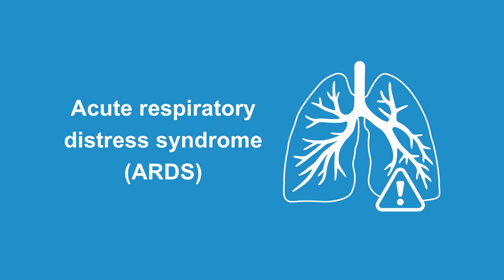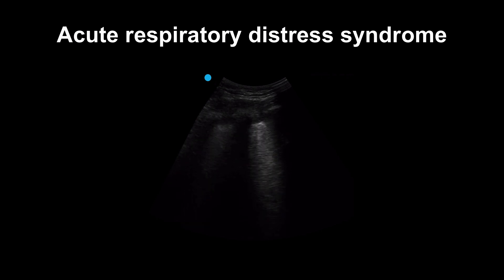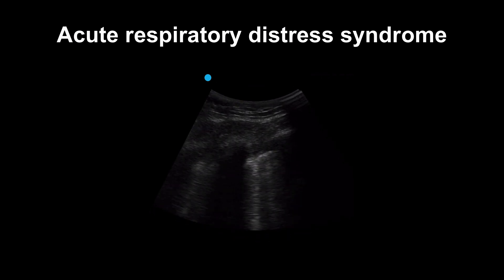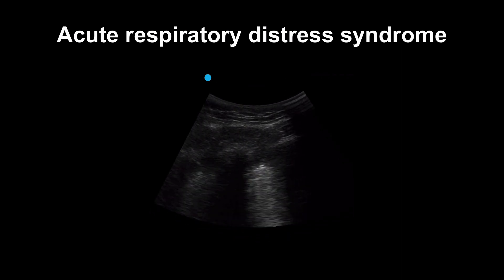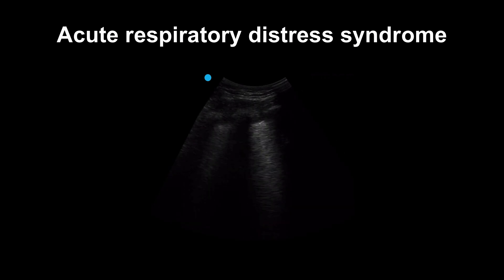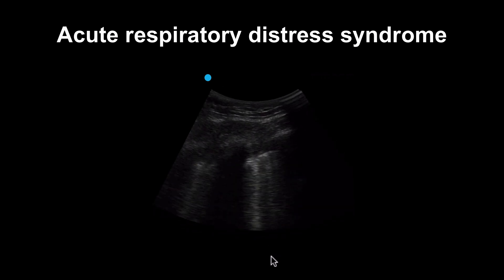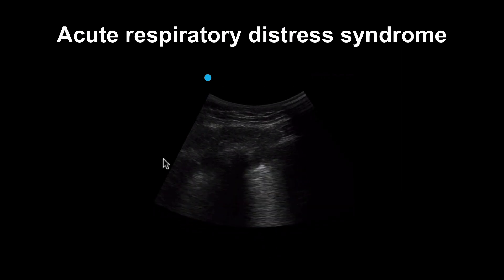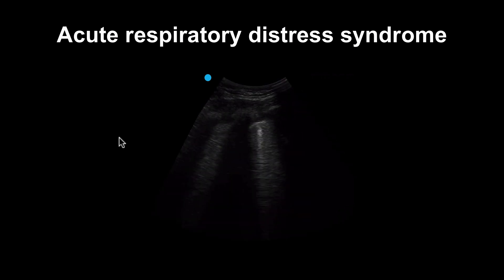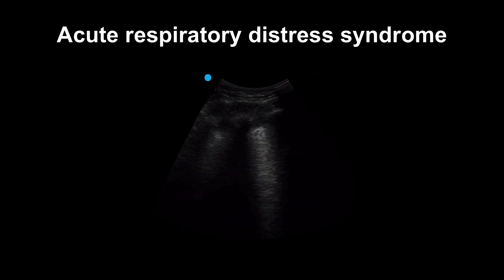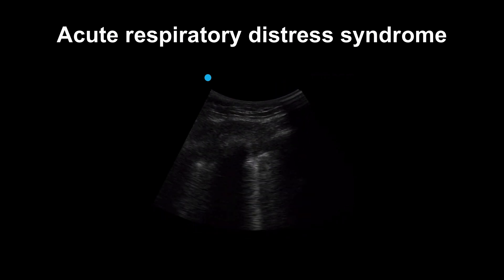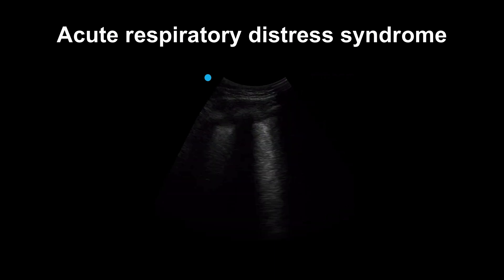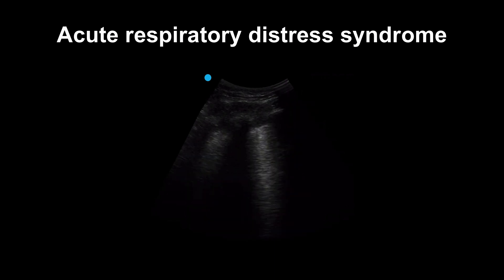What about ARDS? This is a clip obtained from a patient who had ARDS. Notice that we can see a B-line profile — there are a large number of vertical artifacts extending off the pleura down to the bottom of the image. One feature of ARDS on lung ultrasound is diffuse B-lines, but that's also true of patients in pulmonary edema.